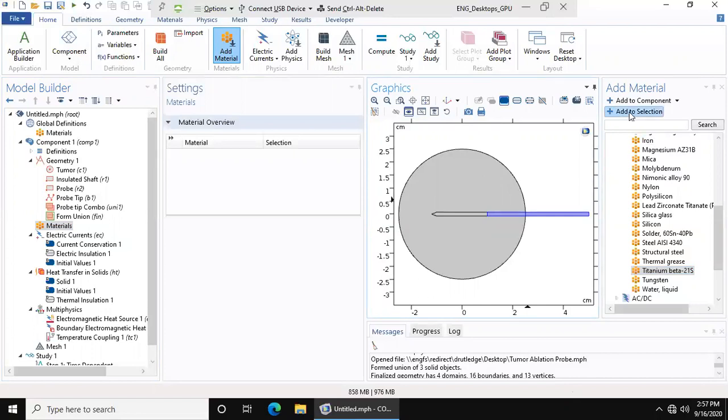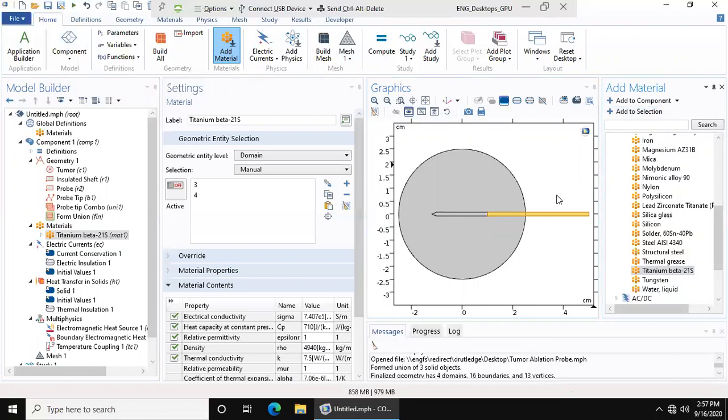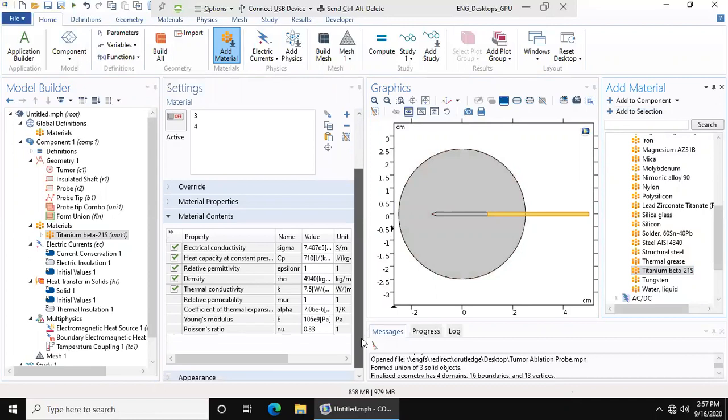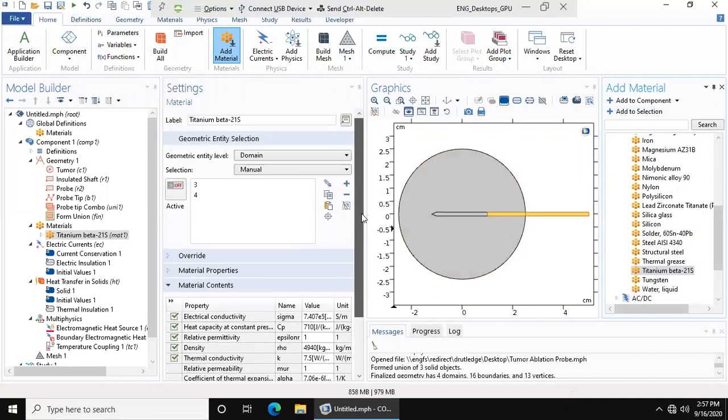Go to add to selection and it'll highlight yellow. It'll give us all the properties and the material settings. We don't want to mess with any of these properties because this is a built-in material.